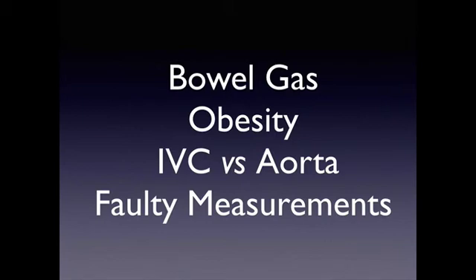But when you have an abdominal aortic aneurysm, when it gets really large, you tend to get a mural thrombus. The mural thrombus is hypoechoic, as opposed to the lumen. The lumen is anechoic, where the blood is actually flowing, and then you have this mural thrombus, both obviously within the aorta. Some people tend to measure the lumen, which is anechoic, giving you a smaller diameter of the aorta, when really it's the entire aorta, including the thrombus, which then is clearly an aneurysm.